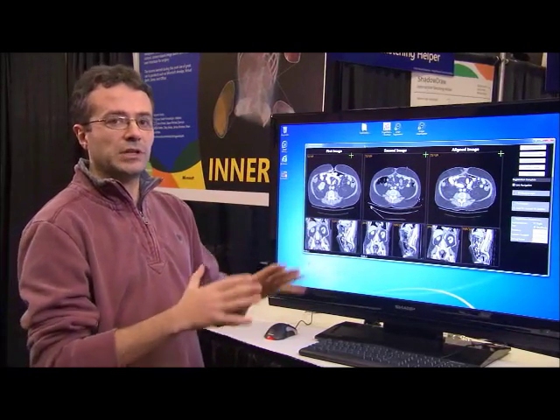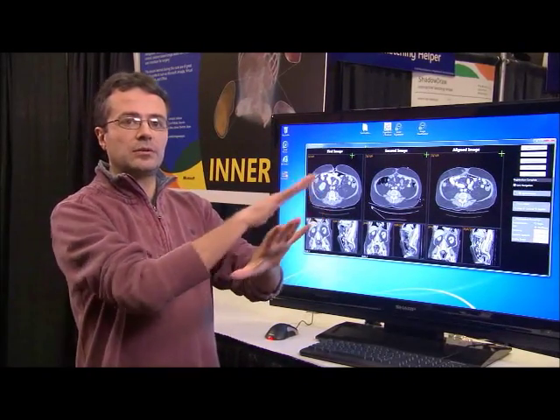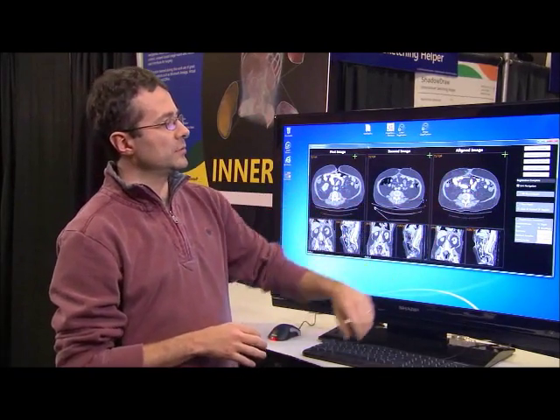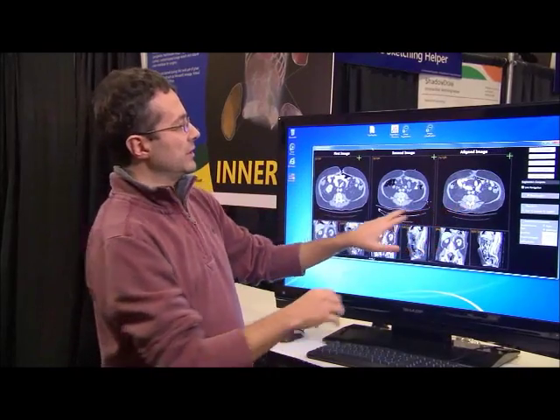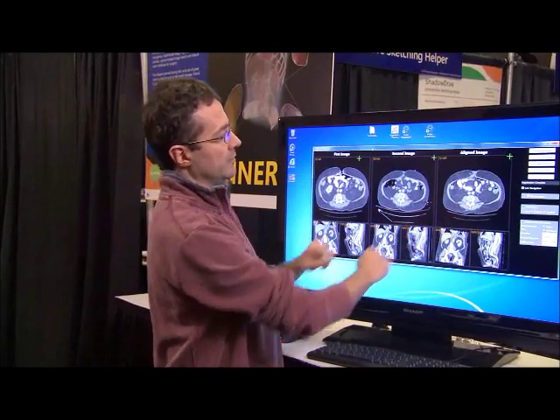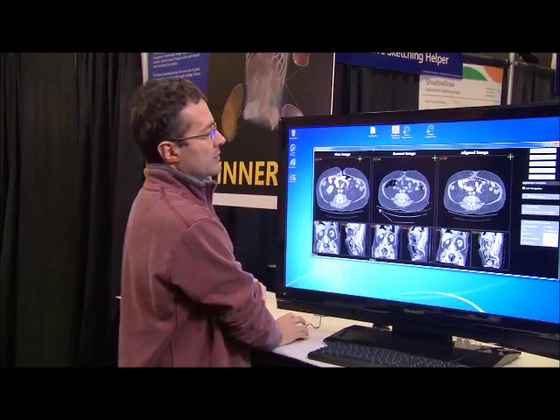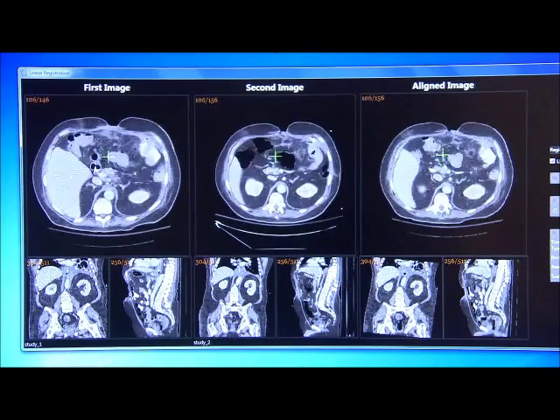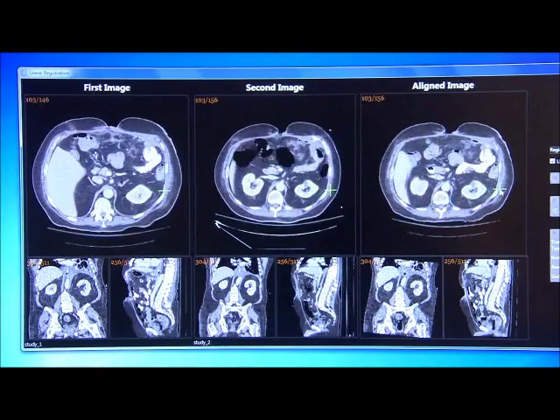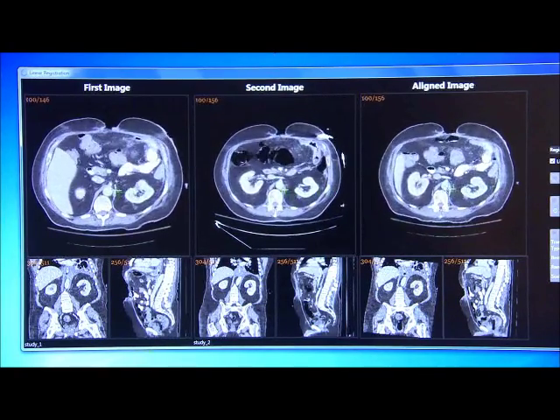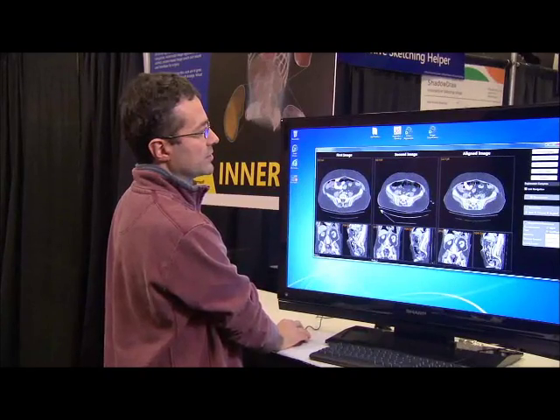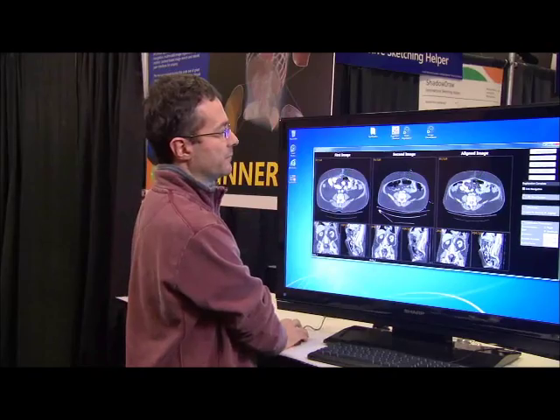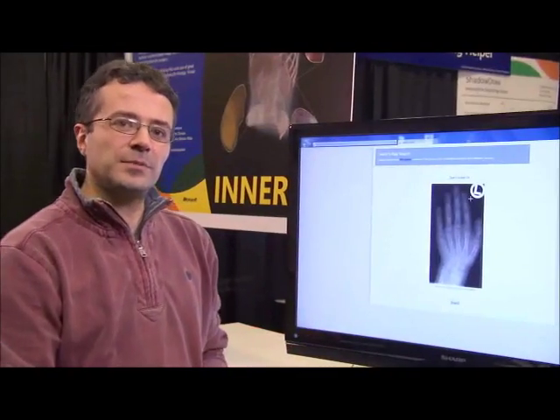Now that we have that information we can align all the organs with one another. We obtain this third view, which is more closely lined up with the middle view. When I move the cursor over I can see the different structures in correspondence — the kidneys or different structures appearing at the same time, or the pelvis, and so on.